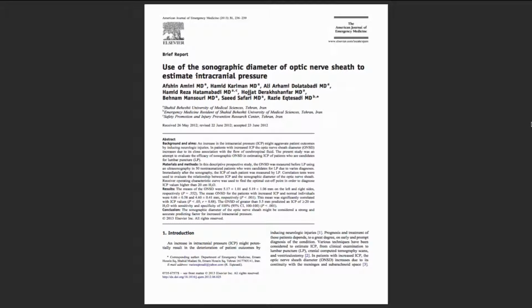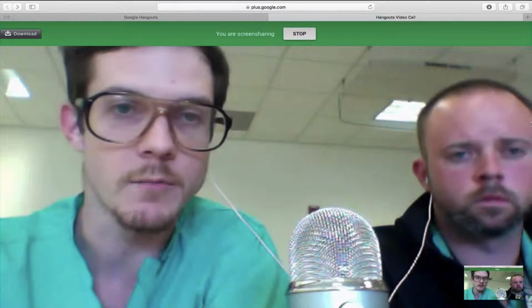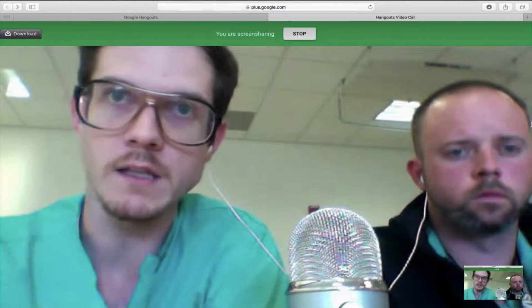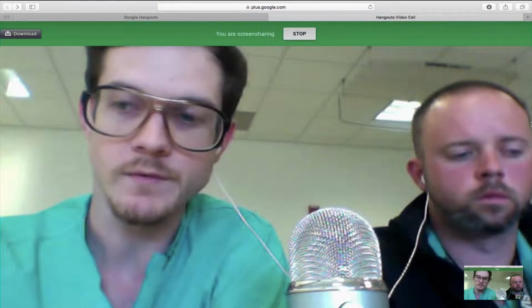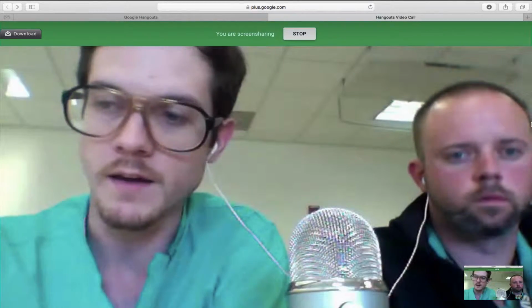So the hypothesis is that there's a correlation between this ultrasound measured ONSD and actual ICP. So this study was a small descriptive prospective study of about 50 patients, where they compared ultrasound measured ONSD immediately before an LP in a non-traumatic patient who was going to necessitate an LP, with the ICP measured by an LP within 10 minutes after that ultrasound measurement of the optic sheath.